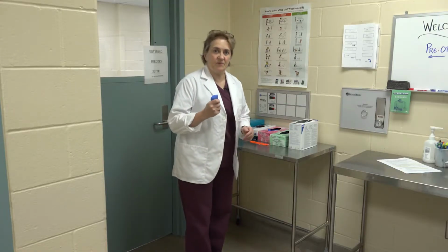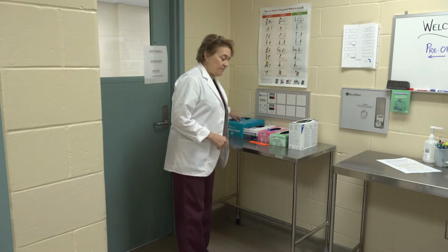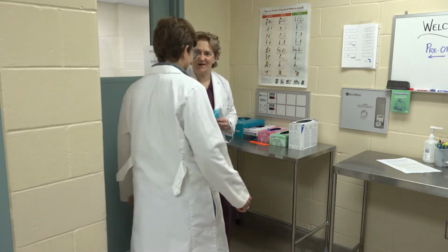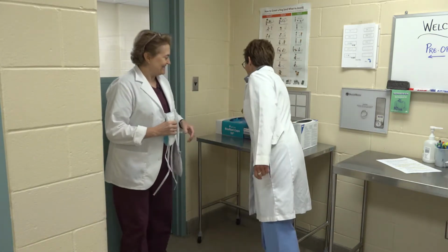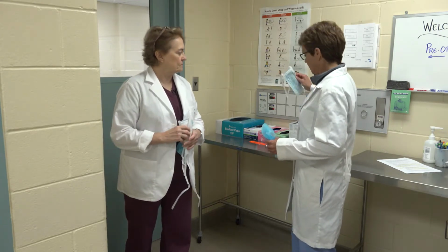Because I'm going to scrub the patient, I'm going to put them in my pocket so I've got them when I need them. And I'm going to grab a cap and mask. Hey, Sue. Hey, Sally, good morning. You ready? I'm ready. It's exciting. I need a cap and a mask. I don't need gloves because I'm not scrubbing the patient.